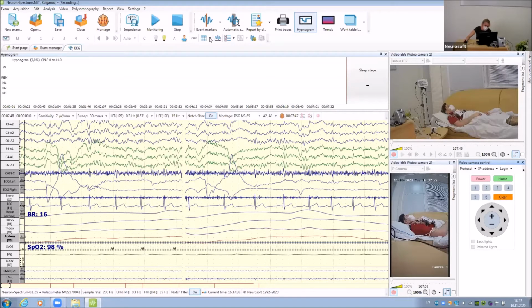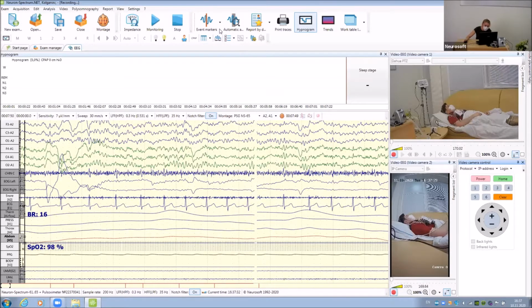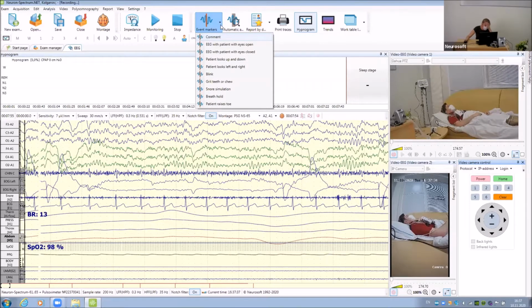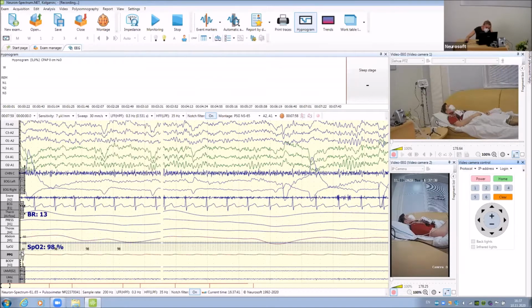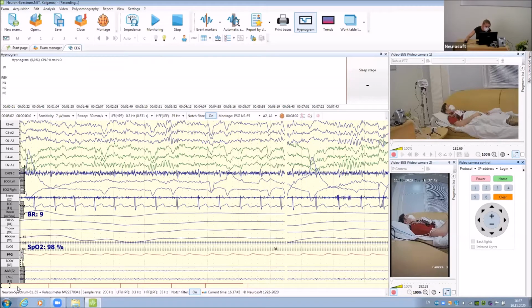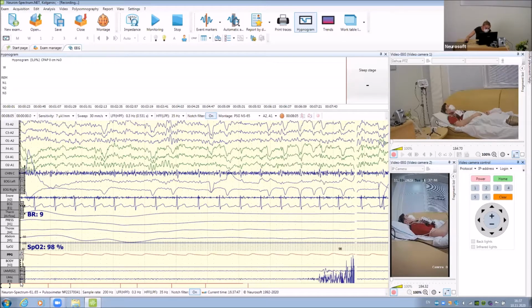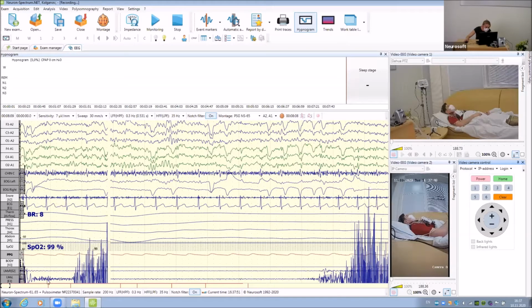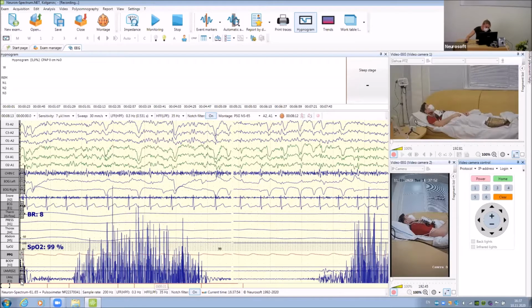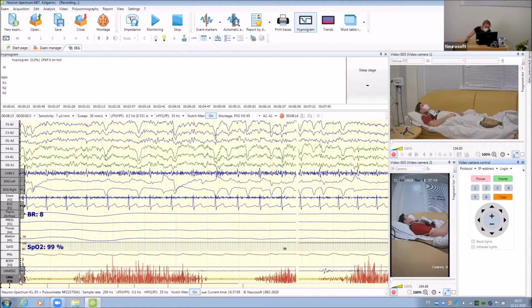So our next maneuver is we should ask our patient to raise their left toes. So we can see this is EMG from the left toes, from the left foot, from the left leg, and you can see very high amplitude. Thank you. High amplitude events.